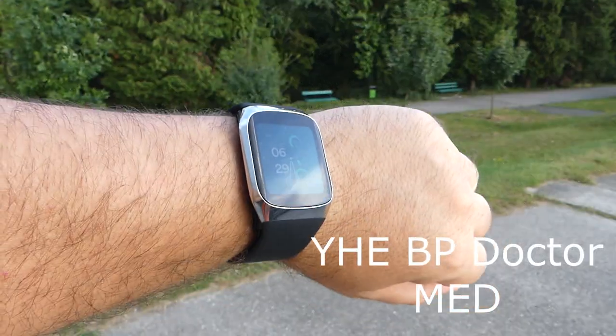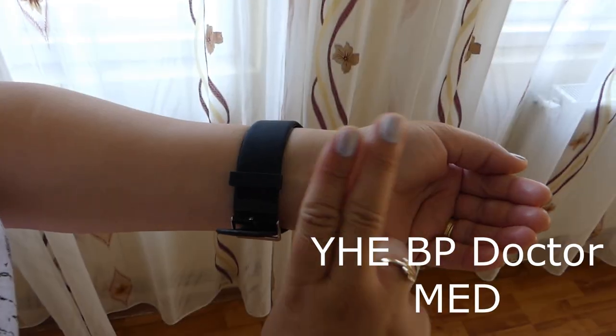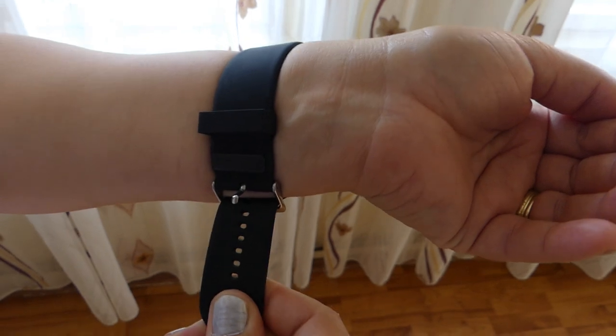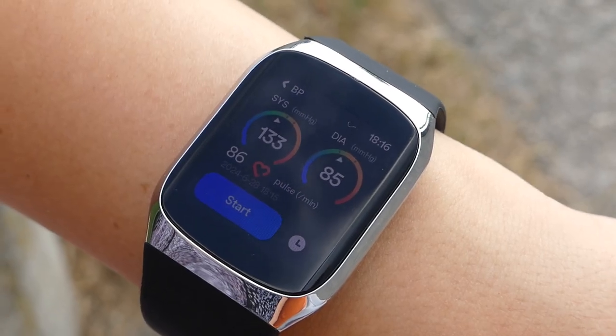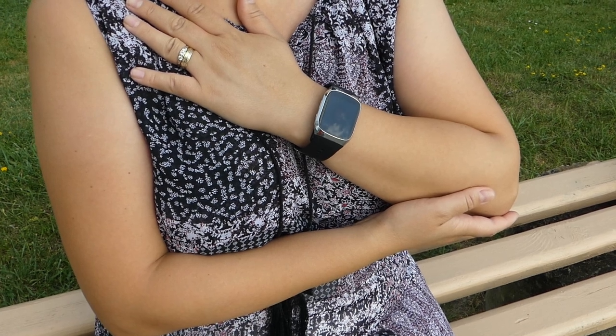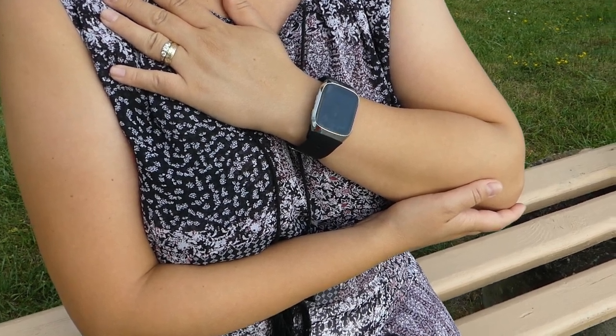Welcome back to the channel where today I'm excited to introduce you to the BP Dr. Med, the world's first medical grade blood pressure smartwatch. This innovative device features an integrated inflatable cuff for highly accurate blood pressure measurements.